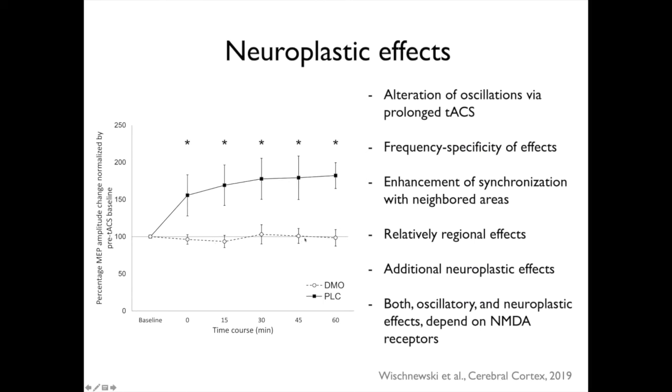So we achieved alteration of oscillations via prolonged tACS. These effects were frequency specific. We saw also an enhancement of synchronization with neighboring areas. We had relatively regional effects, but this was a 4x1 electrode montage, so a bit more focused stimulation. It had additional neuroplastic effects, and both the oscillatory and neuroplastic effects depended on NMDA receptors.